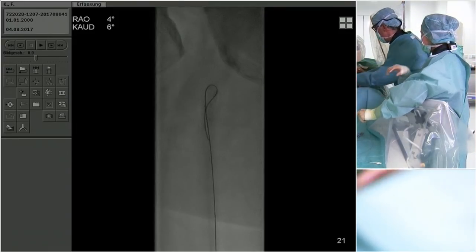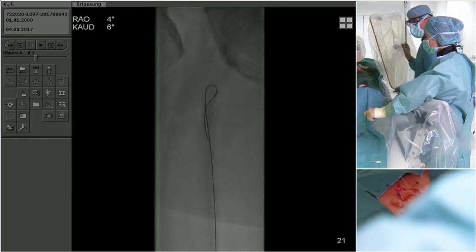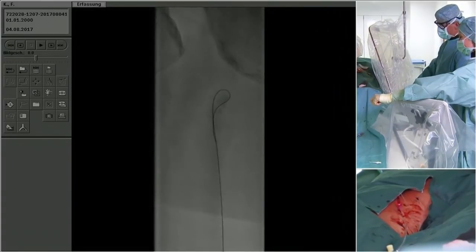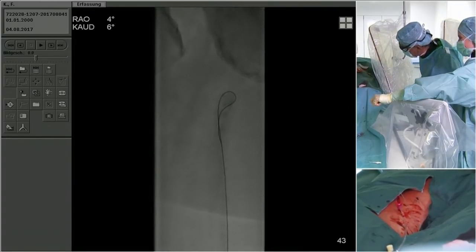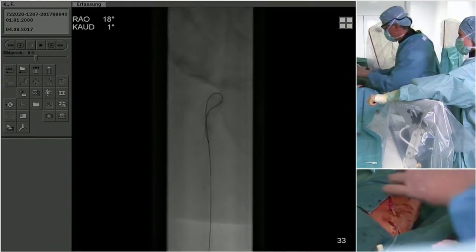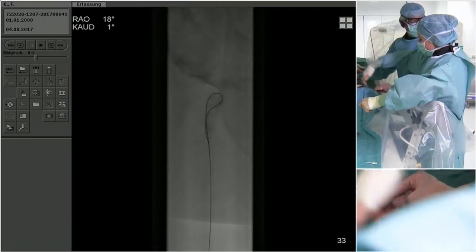So it looks like a very large artery. Are you sure this is not a graft? He did not have a bypass before? No, according to the report, and also no scar here distal, no graft. Yeah, looks big. As you said, doesn't look really atherosclerotic. No. Old occlusion maybe. Judkins here, French?